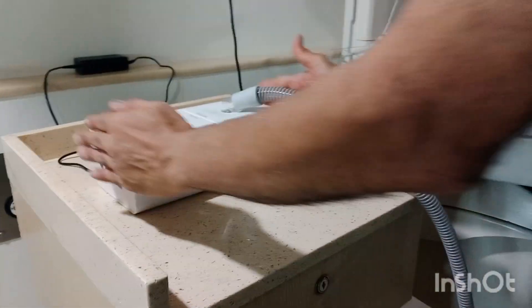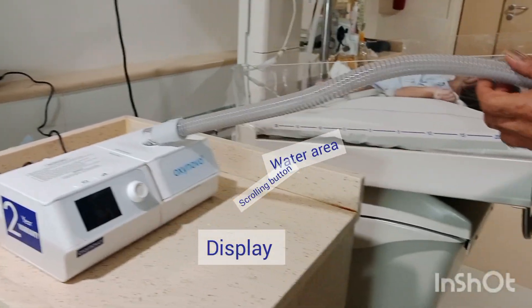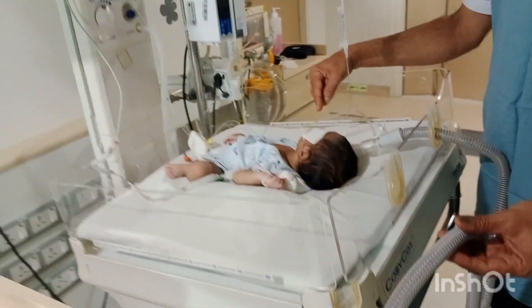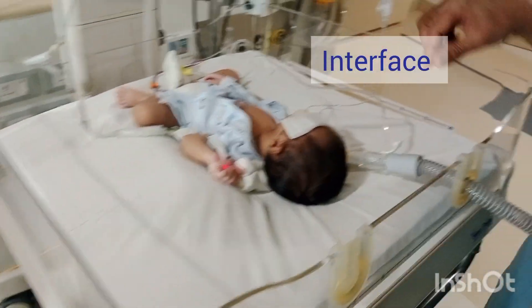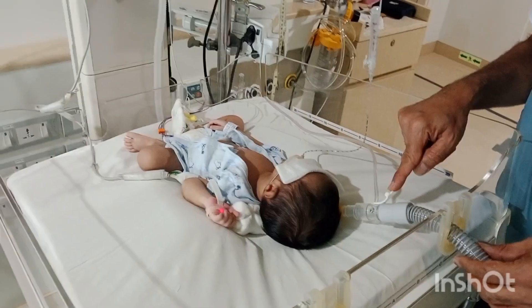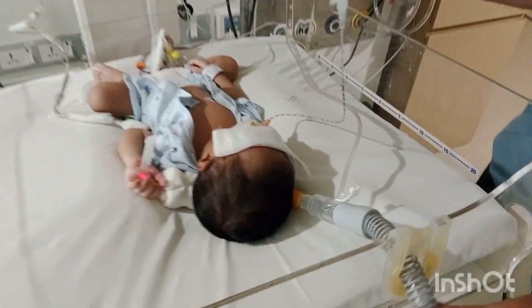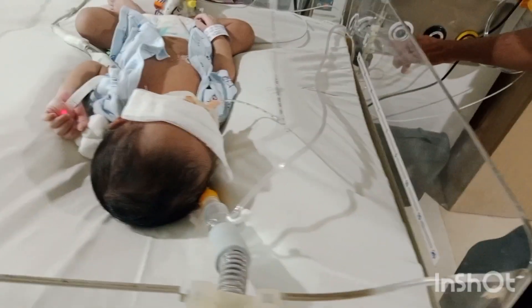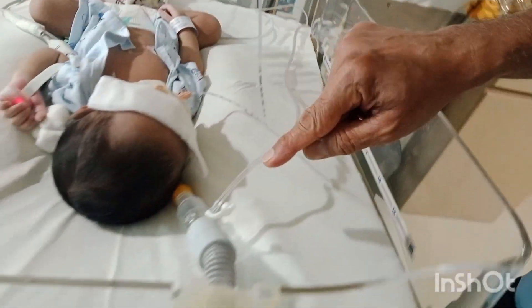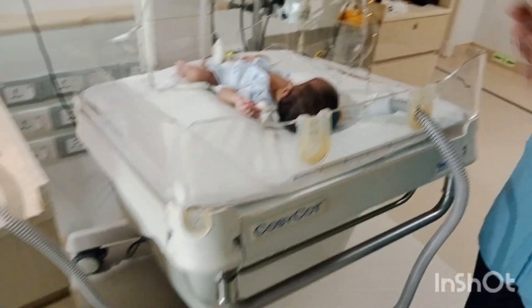Here is the BiPAP device — it is a small device with a tube connected to the interface. We use the Optiflow device interface, and there is a small knob where you can connect oxygen if required. This allows oxygenated air to be delivered to the baby.